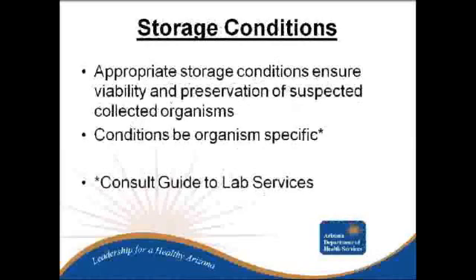So there is a big range for these. They can be organism specific, and if you ever have a question, you can consult the Guide to Laboratory Services for specific organisms' requirements, or again, you can just give us a call. We will go through some of them here in this presentation.